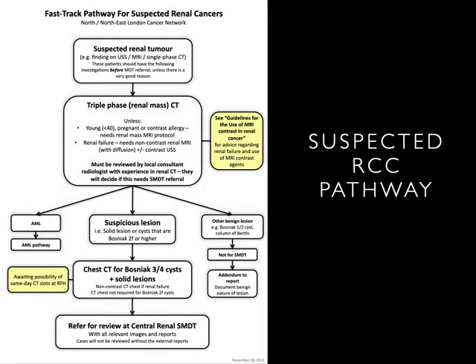So moving on, we have a standard pathway for assessment of most lesions. Most lesions tend to get found as an incidental finding on ultrasound, MRI, or single-phase CT. And our traditional way is to say, okay, what's the simplest thing that will pick up and correctly characterize lesions? It tends to be a triple-phase CT. But if you're young, pregnant, or have a contrast allergy, or you have renal failure, then we go to MRI. And then we can take them down different pathways.